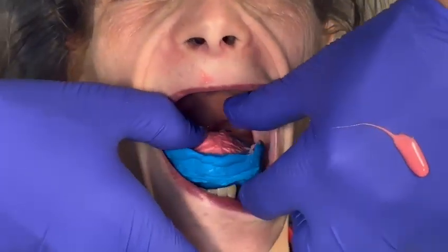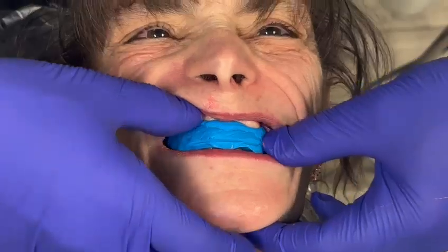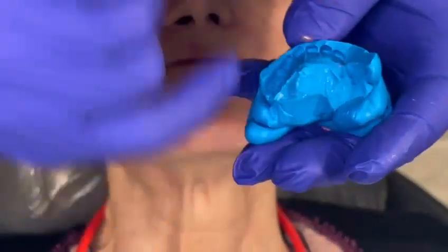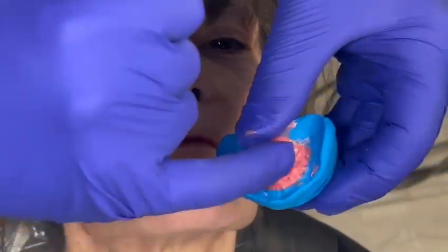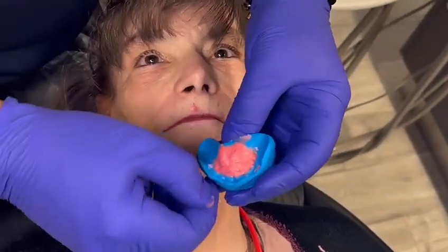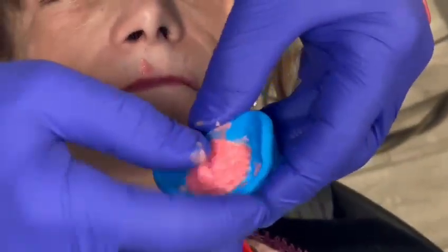She's showing me a repetitive bite every time. Now my designer can align the incisal edges in here to her lower teeth and the rugae to the upper teeth. Because it's soft tissue and a little bit of floating records, there may be about a half millimeter of discrepancy, but it'll be an awesome first working vertical. It'll be really great.